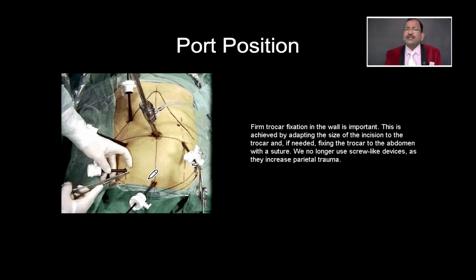Because if two or three times the cannula comes out from the wound, it becomes loose, and now gas will keep on leaking. So we should stabilize the cannula, because surgery may take three to four hours. And gas will keep on leaking, and once the gas leaks, what happens? Dryness of the bowel and hypothermia. These chances are always there.